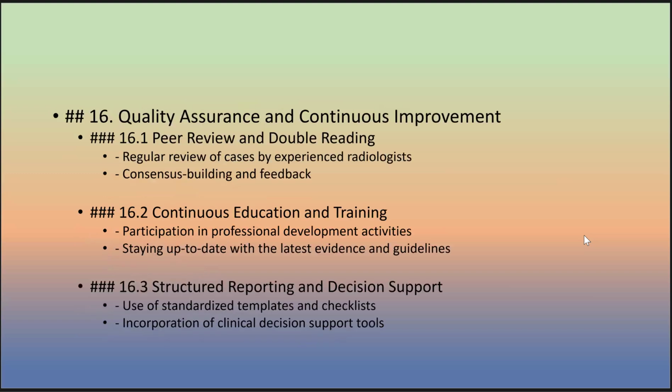Quality assurance and continuous improvement: peer review and double reading, regular review of cases by experienced radiologists, consensus building and feedback.